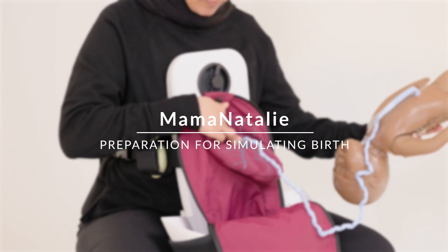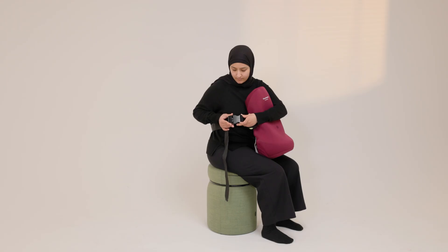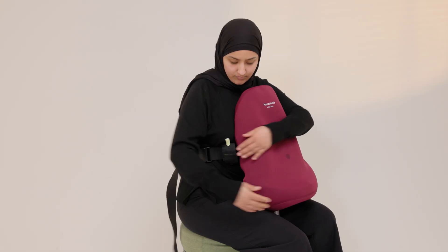Preparation for simulating birth. Strap Momnataly around your waist. Adjust the belt so that the simulator is secure and snug against your body.